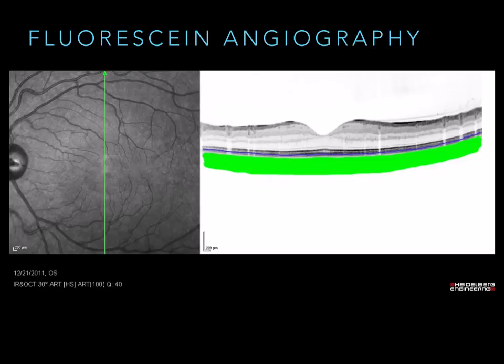So when you start your fluorescein angiogram, actually the large choroidal vessels do not allow fluorescein through them. It's the choriocapillaris that has the fenestrations that are facing the RPE that lets it through, but basically it fills up the whole choroid. That supplies the outer portion of the retina. I drew a blue line there. I don't know if you could see it.